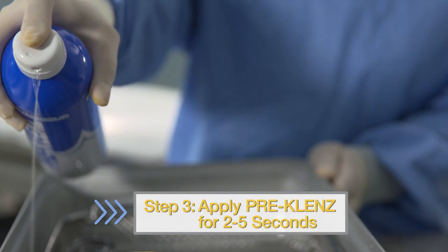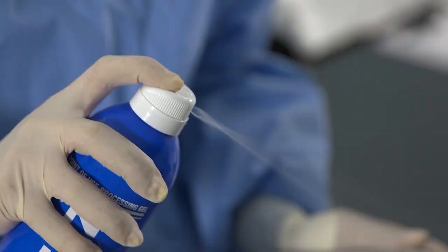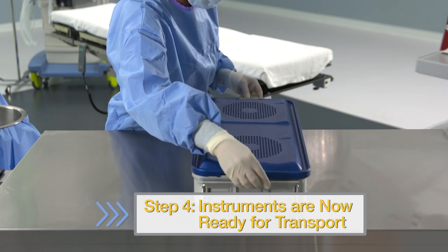Step 3: Apply the Pre-Cleanse gel for two to five seconds with a sweeping motion, and lift your finger to stop dispensing. Step 4: Instruments are now ready for transport.